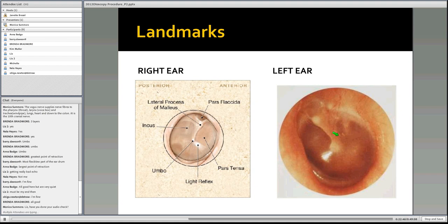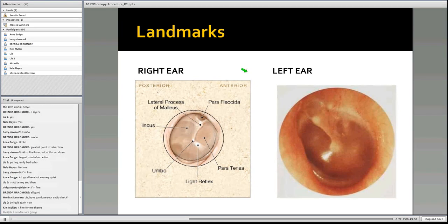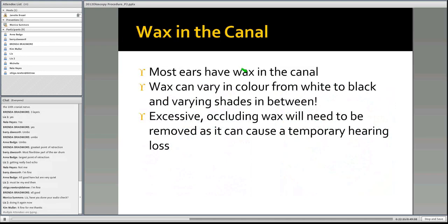All right, so that's the left and the right here. Let's see what we've got next. All right, so we're going to start having a look at what we might see down the ear. And one of the things that you will see in nine cases out of 10 is wax in the ear canal. Most ears will have wax in the canal, and it's there for a reason.